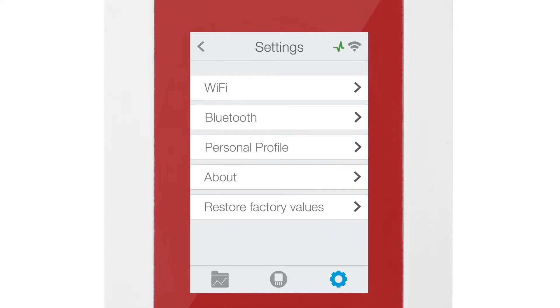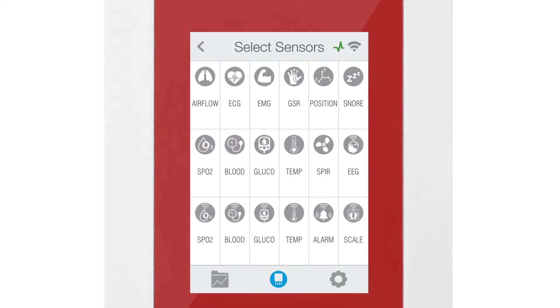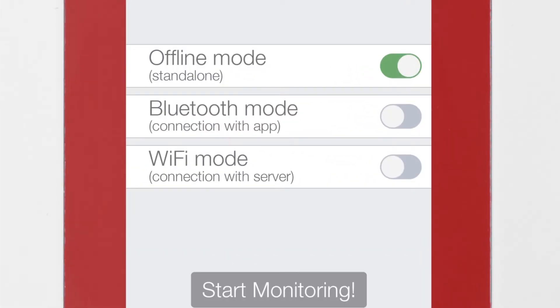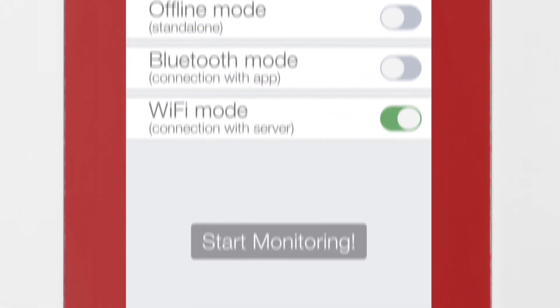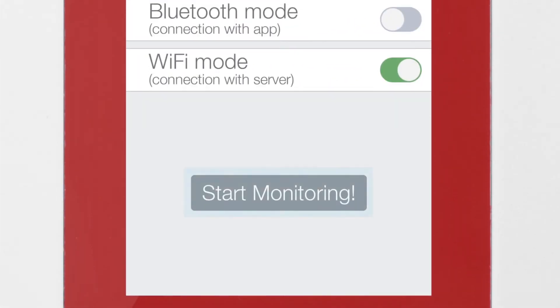Now click on the Back button until you access the Configuration menu. Once you are there, click on Wi-Fi mode and then on Start Monitoring.